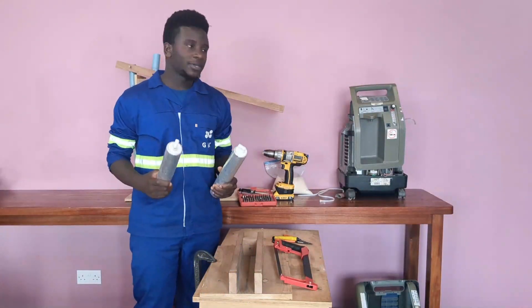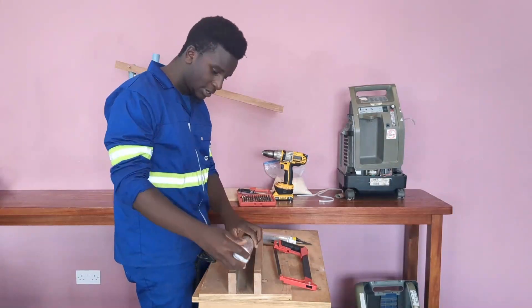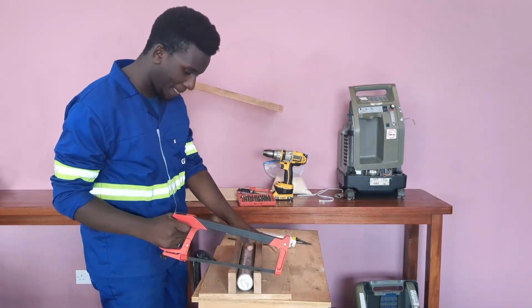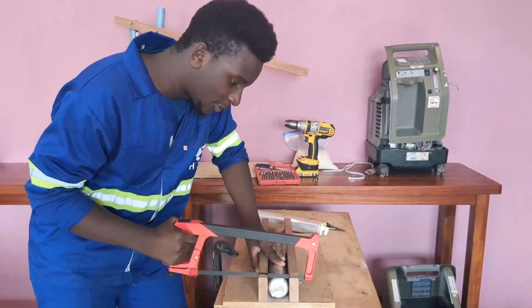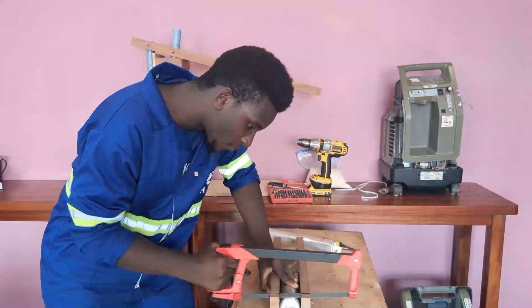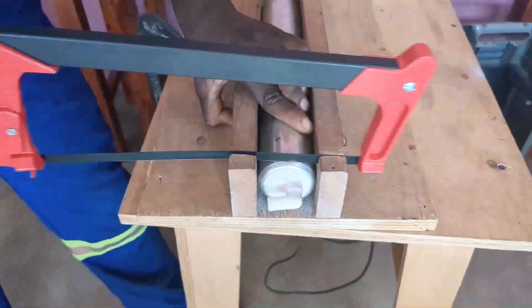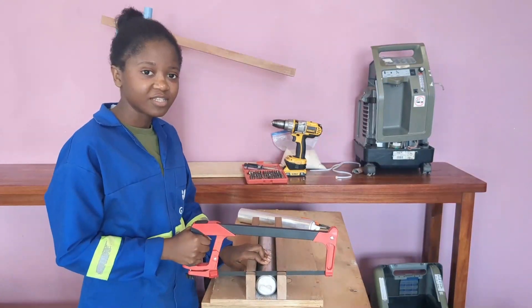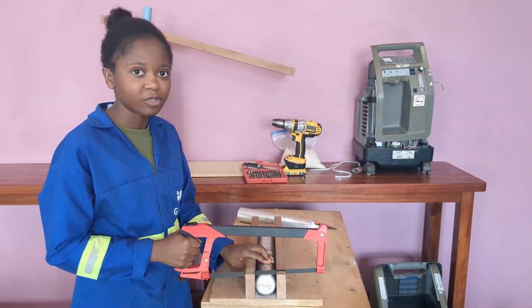After removing the sieve beds from the concentrator, it's now time to start cutting them. Take the sieve bed, place it on the jig, then take your hacksaw and start cutting. As you are cutting the sieve bed, make sure you are rotating it to ensure that it is being cut evenly. Please take note that inside the sieve bed there is a spring that can fly out and harm those around you and even yourself, so be careful.